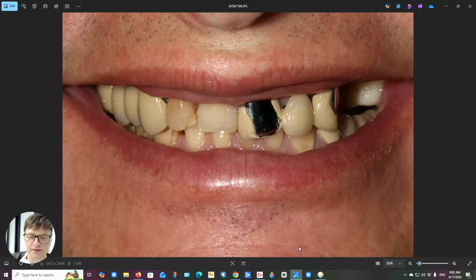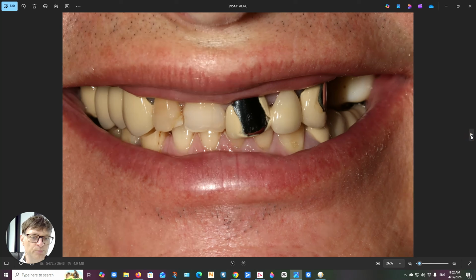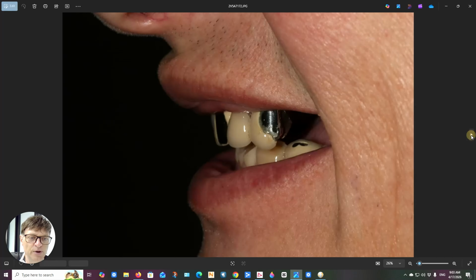This is Dr. Huson. I'd like to just quickly show you our case of the month for this month. We had the most lovely gentleman come see us a while back. He had broken his teeth severely. You can see how the porcelain had broken off the bridges. He was grinding his teeth to pieces. He couldn't eat his food properly because they were just chipping and breaking. He lost teeth on the sides, and he just decided he'd had enough.